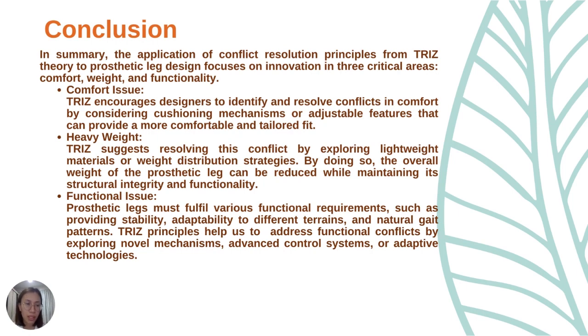So, in conclusion, the application of conflict resolution principles from TRIZ theory to prosthetic leg design focuses on innovation in three critical areas, which are comfort, weight, and functionality. TRIZ encourages us to identify and resolve conflict in comfort by considering cushioning mechanisms or adjustable features that can provide a more comfortable and tailored fit.